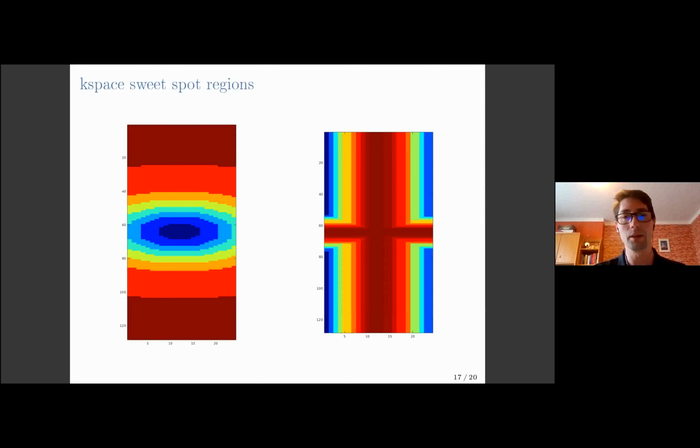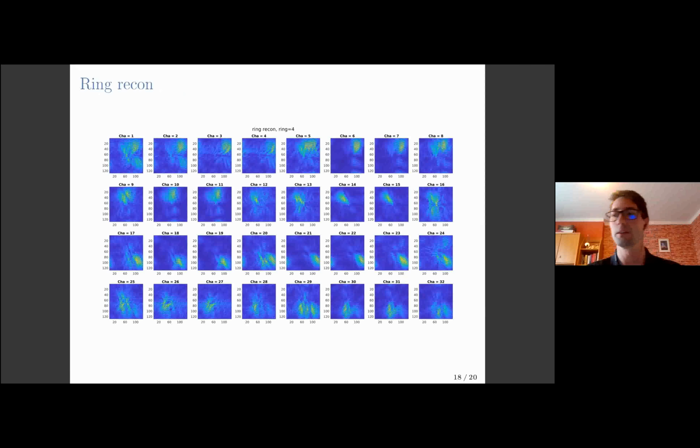And if you take a look at the signals reconstructed from just those particular regions in the K-space, you may find that for the rings, there are some channels which show us those kind of radar plots, especially if you take a look at the channels 6 and 7 and those two columns.